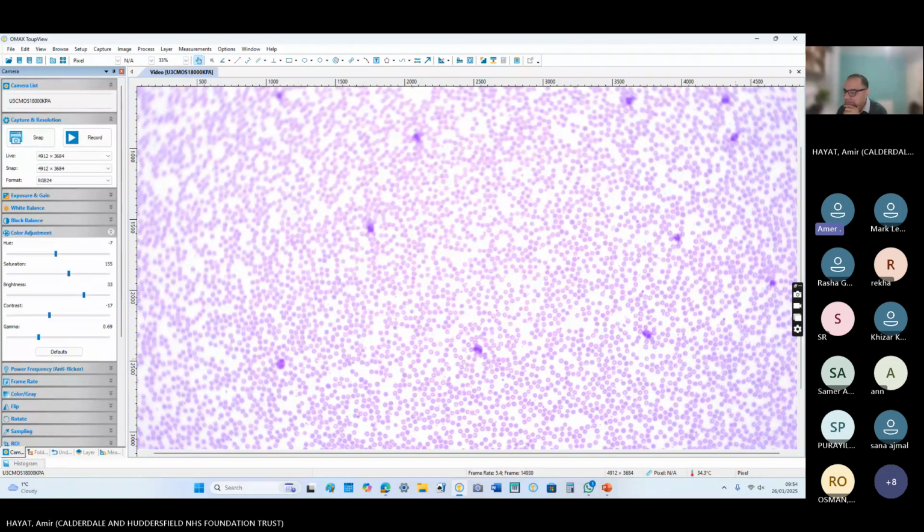So what do you suspect if this is the full blood count of a patient? Seems to be a lot of eosinophils, maybe reactive. Yeah, eczema or like helminthic infection. What infection? Worm infestation, helminthic. Worm infestation.